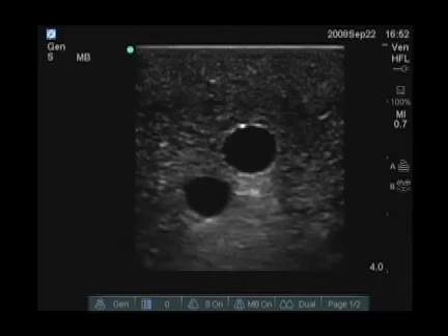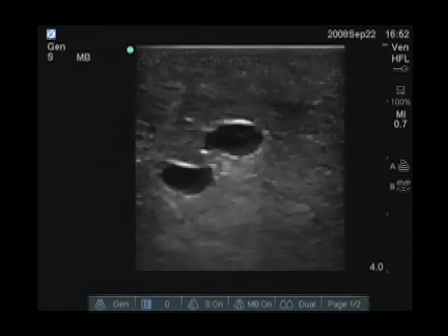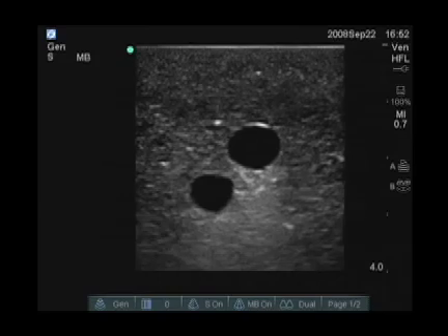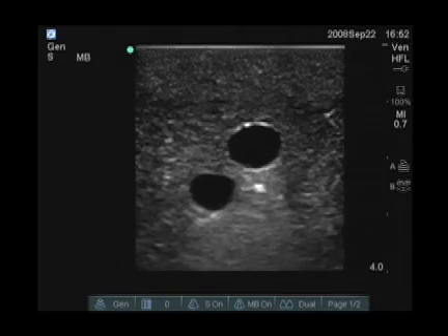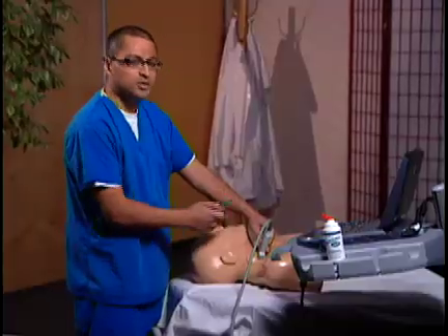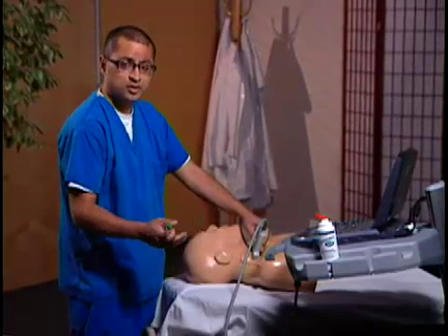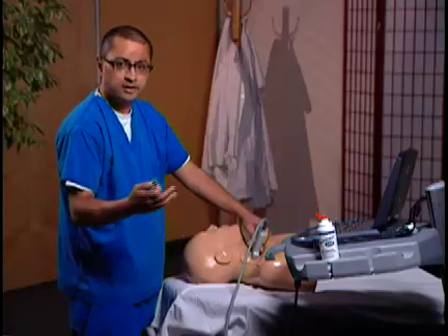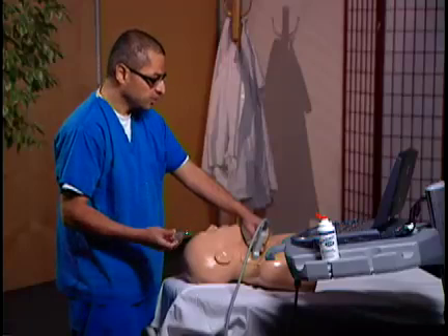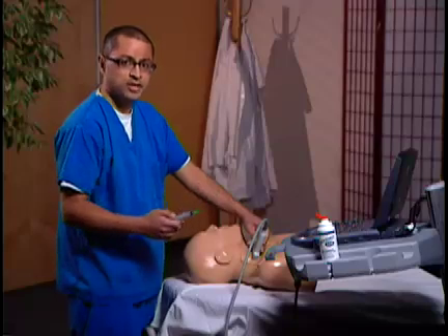On this image, we can see what is supposed to be a vein here in the center — it's compressible and about a centimeter deep or so. Normally this whole setup will be under sterile procedure: the transducer will be covered with a sterile sheath, I'll be in full sterile prep, and the needle and the rest of the equipment will all be sterile. But for the purposes of this demonstration, you'll recognize how I'm placing the needle and how we're cannulating the vein.